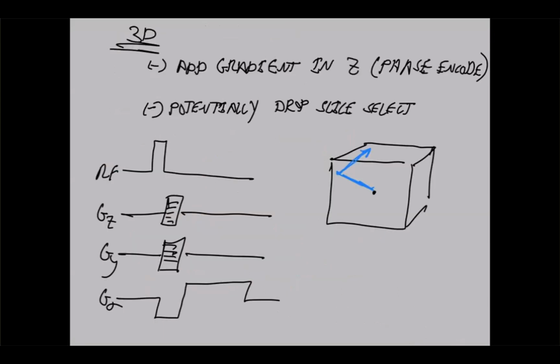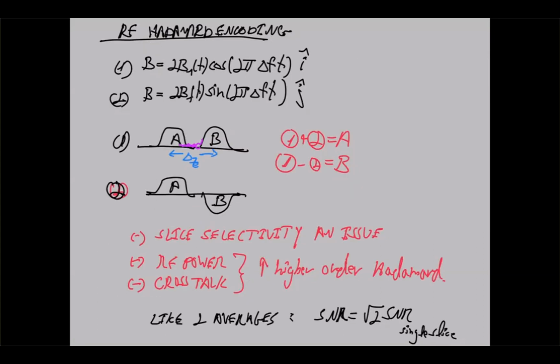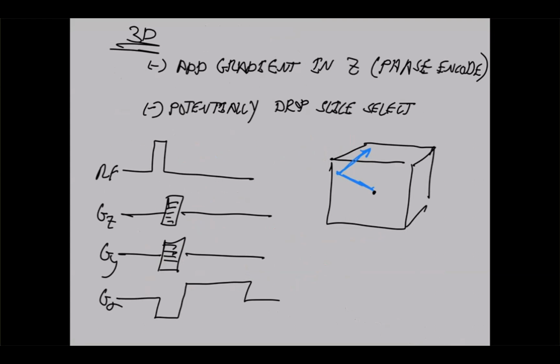All right, so let's now, okay, so this is kind of 3D, but it's really kind of 2D plus, right? Because you get 2 slices, 3 slices, so on and so forth, but that's 8 slices at most, but that's it. With 3D, for example, you have a volume which you want to image, and you apply a potentially, without any slice selection, although you can still do slice selection, but often will be a very large slab that you would excite. And then this thing is familiar, right?